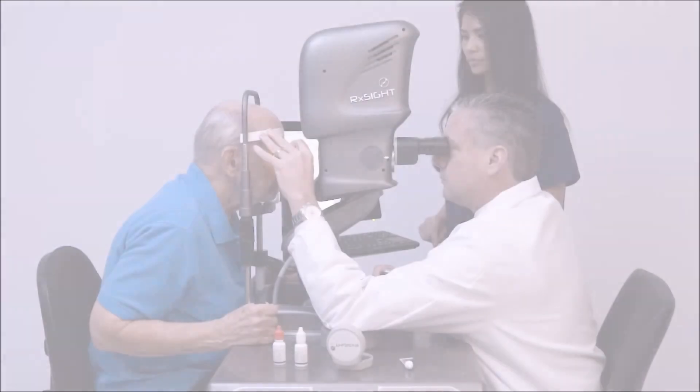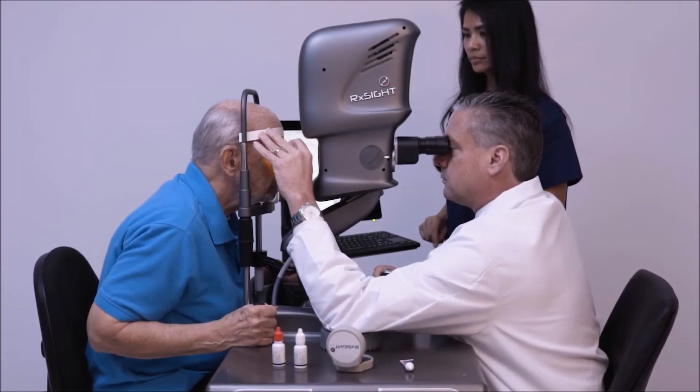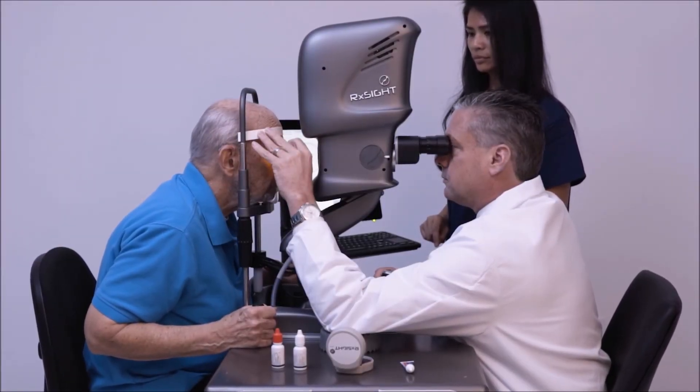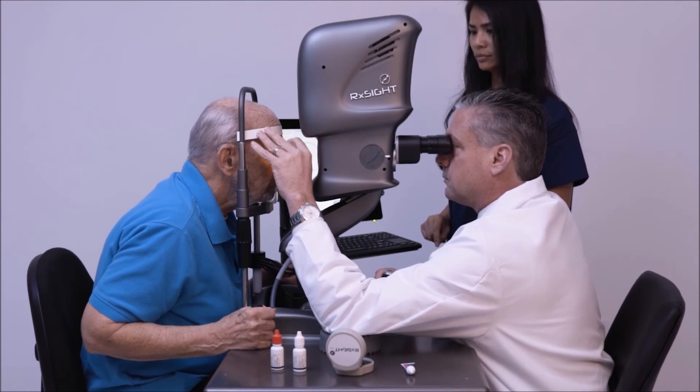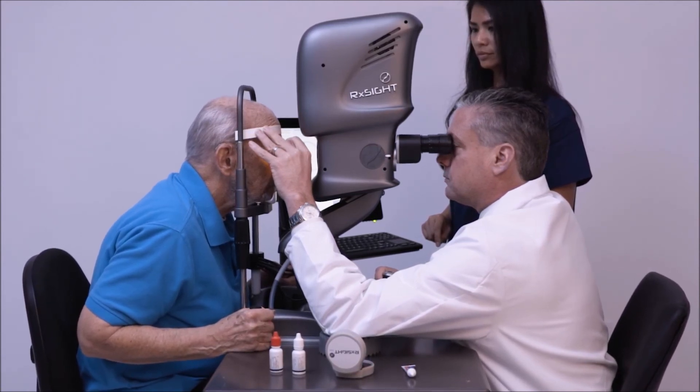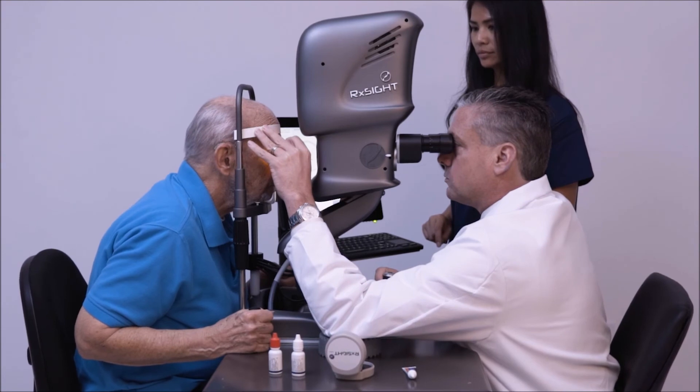This treatment process, which is approximately 90 seconds in duration, is referred to as lock-in. 24 hours after the RxLAL is locked in, the patient may discontinue wear of the UV-protective glasses.